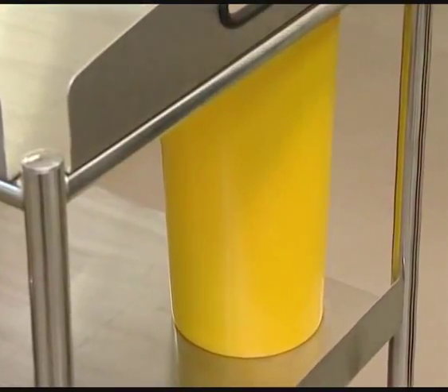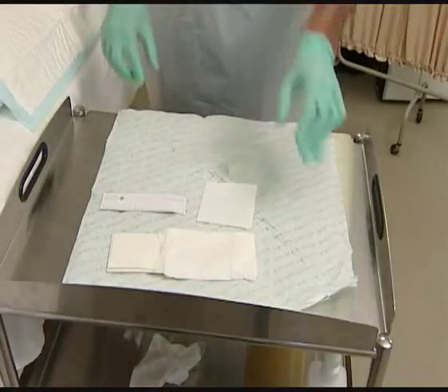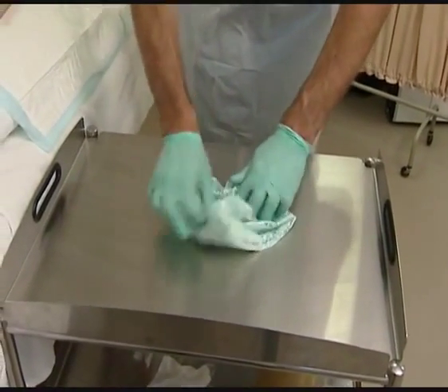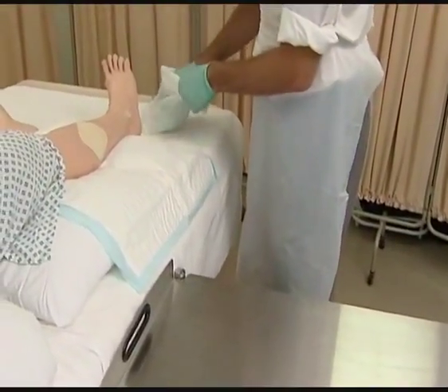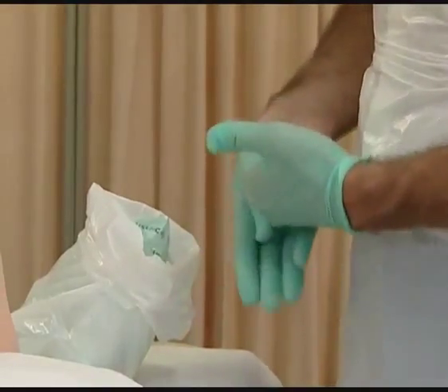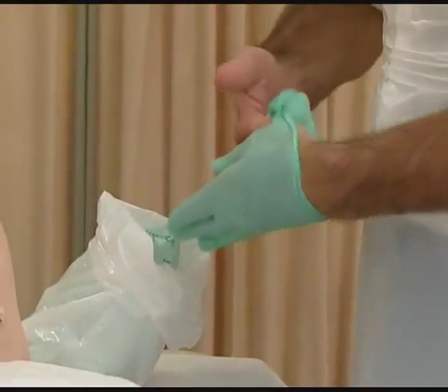Ensure that sharps are disposed of into a sharps bin which you will have brought with you to the bedside. Fold up the sterile field with the contents inside and discard into the relevant waste stream depending upon your location. Return reusable items to the sterile supply department for reprocessing. Remove your gloves without contaminating your skin and drop them into the waste bag.